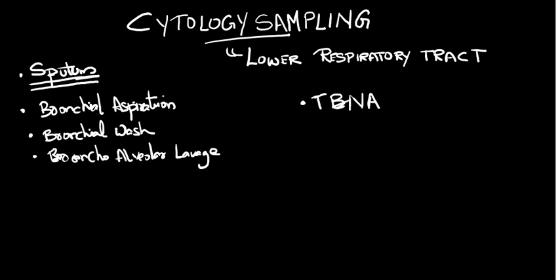Then another technique very similar to TBNA, but where we use ultrasound, is called EBUS, or endobronchial ultrasound guided needle aspiration, EBUS FNAC.